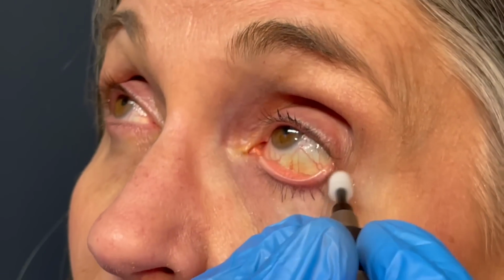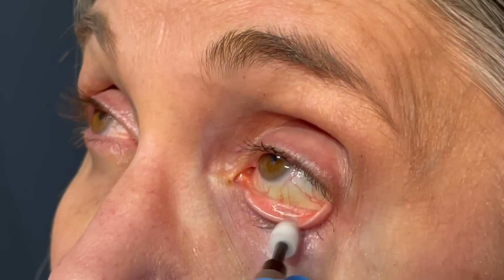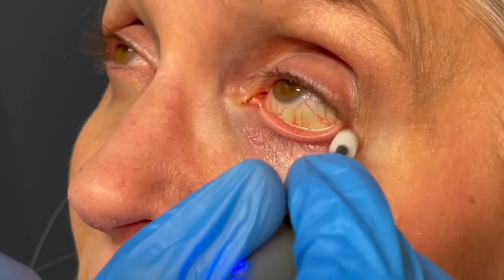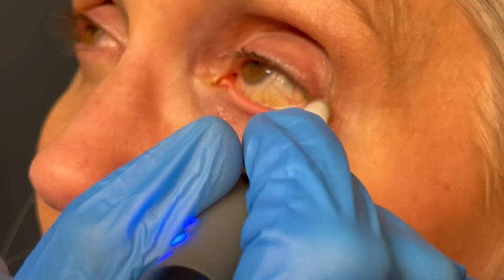Ready. Okay. Once again, lean your head back. Look up as high as you can go for me. You just keep looking up. Removing all the caked up hardened oil and any crustiness, the biofilm, dead skin cells, anything around the eyelids that's causing any eye irritation, dryness issues.